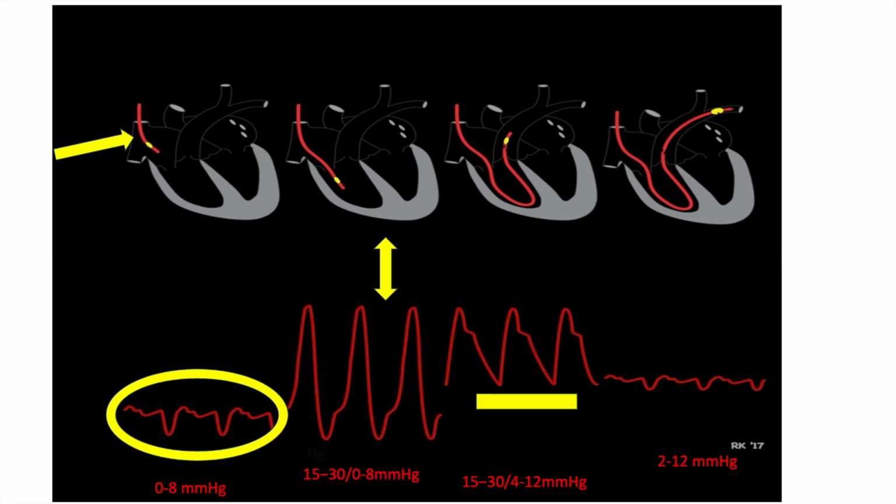the new guideline. Then you have to further advance the PA catheter, and when it reaches one of the branches of the pulmonary artery, you will see the waveform has changed, and this reading denotes the pulmonary capillary wedge pressure. The normal range of pulmonary capillary wedge pressure is 2 to 12 mm Hg.